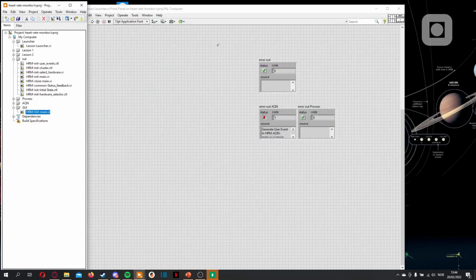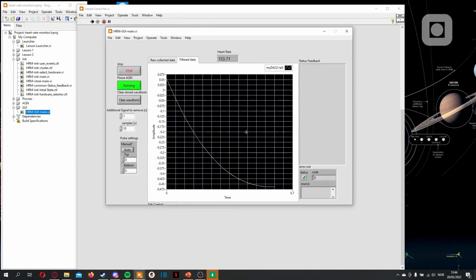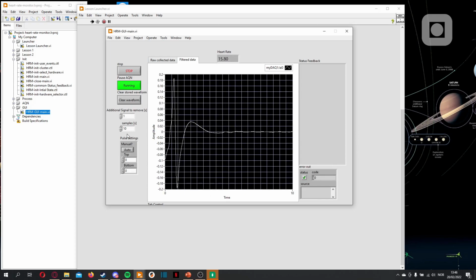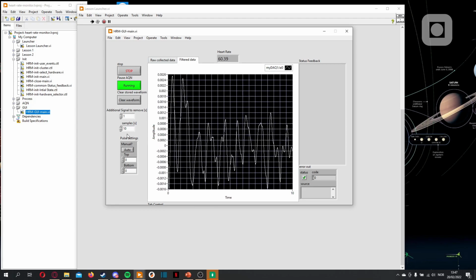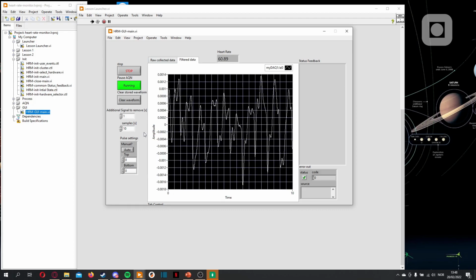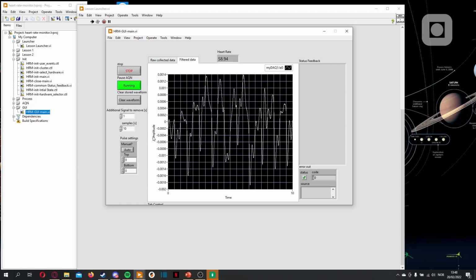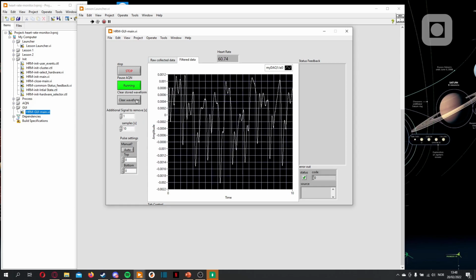Now let's try it one last time. And yeah, let's choose the MyDAC. So that's it for this lesson. It works a bit janky because of the light condition and talking at the same time. You need to be very still when taking the measurement. In the next lesson, we'll focus on making this into an application which is both an exe file, so you don't need a project, but also an installer, so you don't need to actually have LabVIEW on the computer you're running this.